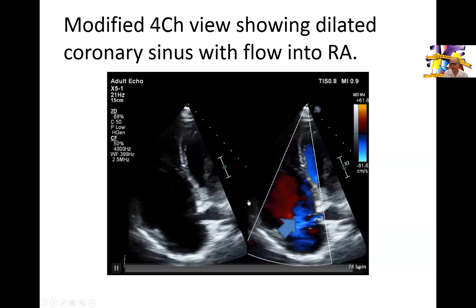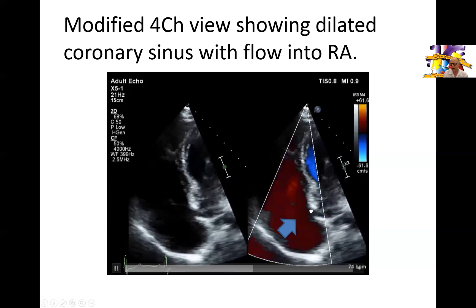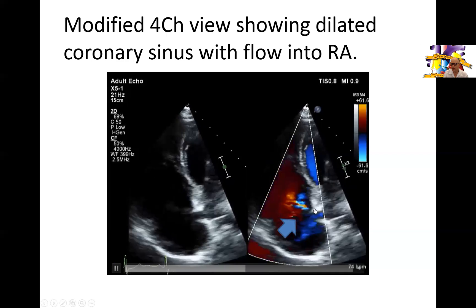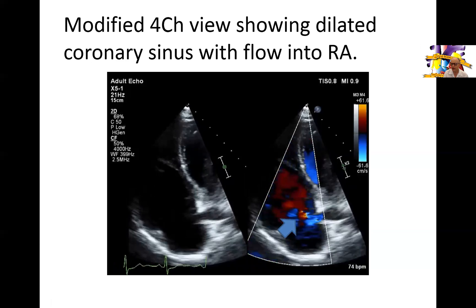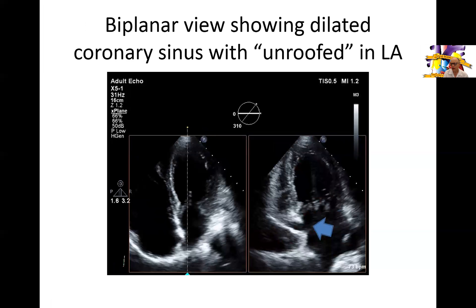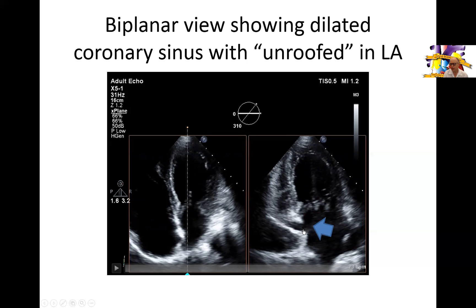Then we move again to look at the coronary sinus. You can see the tricuspid valve here, and then the coronary sinus right here, again dilated, with some flow coming from the coronary sinus and emptying into the right atrium. There is some turbulence of flow, which is not something we see frequently given that the flow in the coronary sinus normally has very low velocity. Here you can see this coronary sinus now with its connection to the left atrium — something that should not happen. The coronary sinus should be sealed right there, with a complete line of separation, but in this instance it is opening into the left atrium.